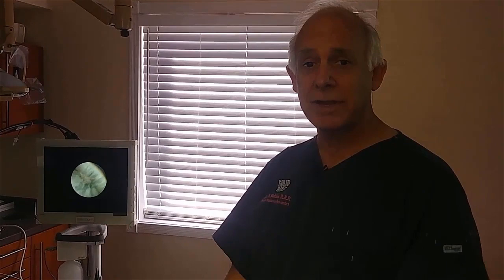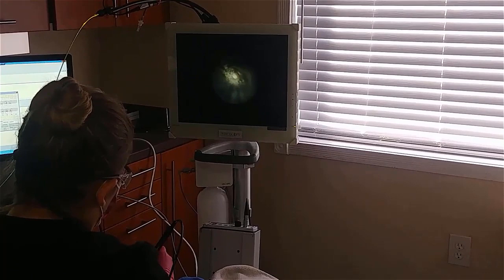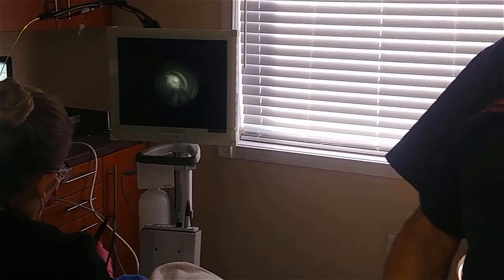Amanda is going in with an ultrasonic scaler — the same type used in any hygiene office — but now she knows exactly where to go because she's been able to see where the calculus is on the scope. You can see this same area on the root surface: now the calculus is gone, the root surface is clean, and the patient will heal.